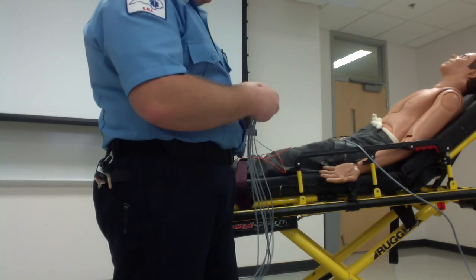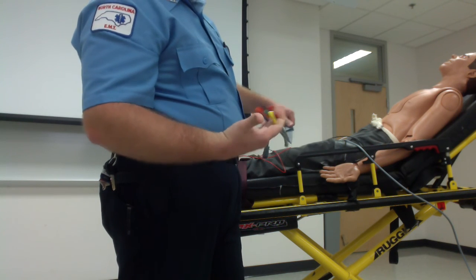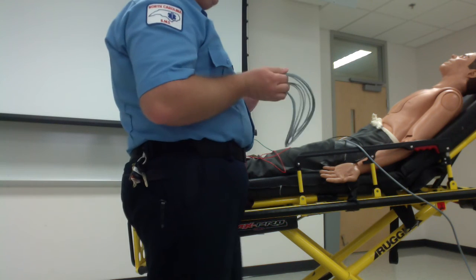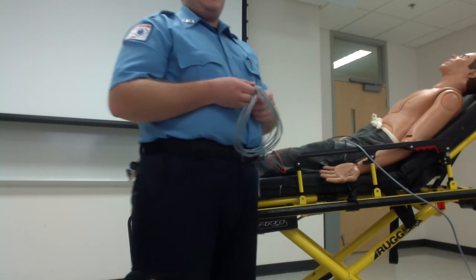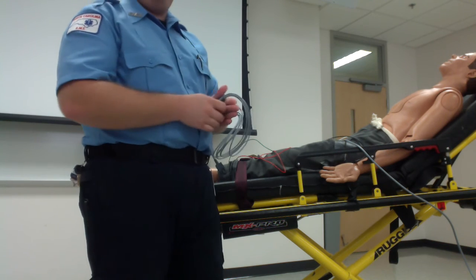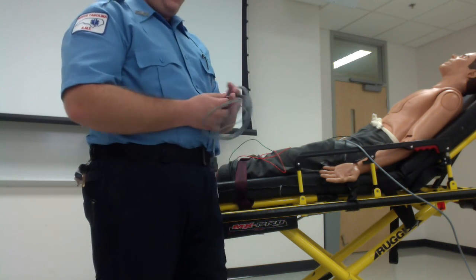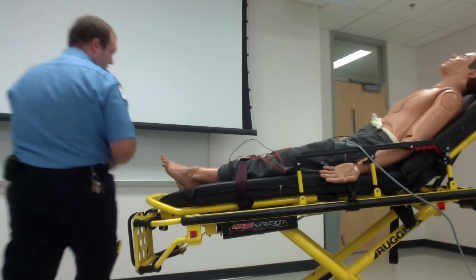The next section is the same thing with your other wires, your precordial wires. As you pull them out, sort them out in your fingers so it's somewhat neat. While your partner or someone else is sticking these wires on the patient, have whoever else is with you put the patient's information in the monitor. That way you're cutting out time and being ready to go.